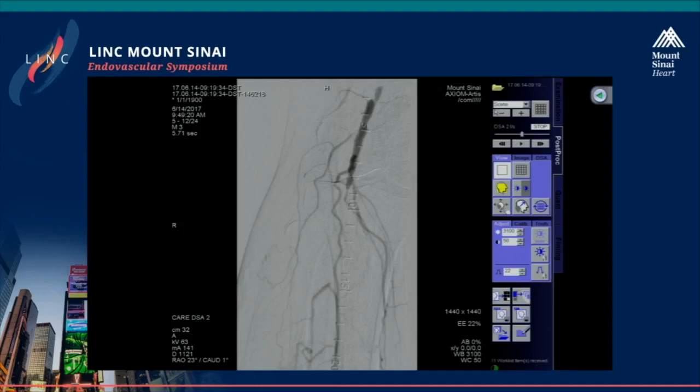I think I already crossed one area where you saw it pop into what I feel is a better lumen. So I think this may be hibernating in certain areas, even though we couldn't see it. I think there's a proximal occlusion, a hibernating segment, and a distal occlusion. If you could see the popliteal, you could see the distal pop as the AT comes off, there's a little beak. I think that little beak is the hibernating area of the distal popliteal, and we should be able to pop in that with a hydrophilic wire. So that's kind of my thought here.